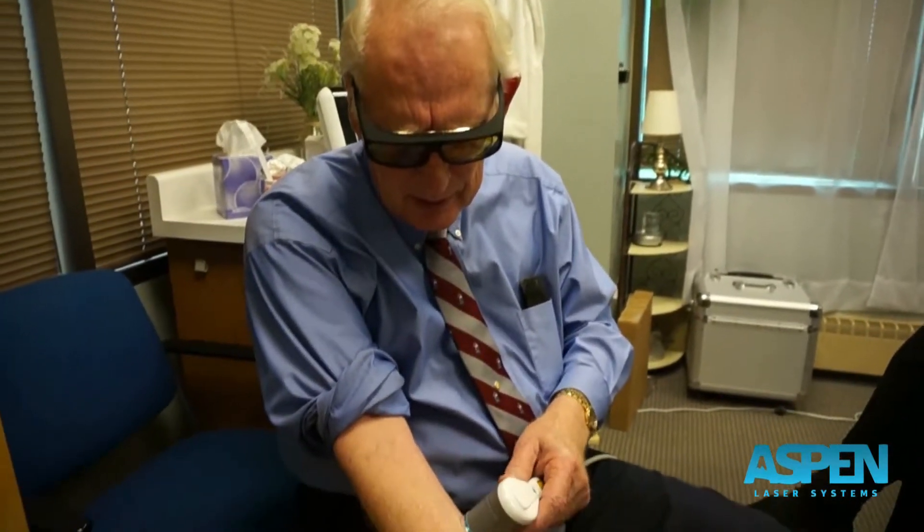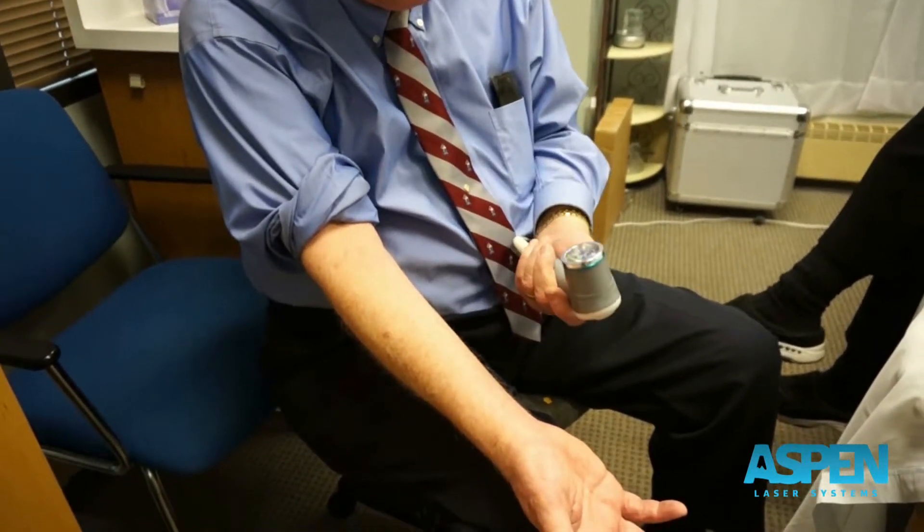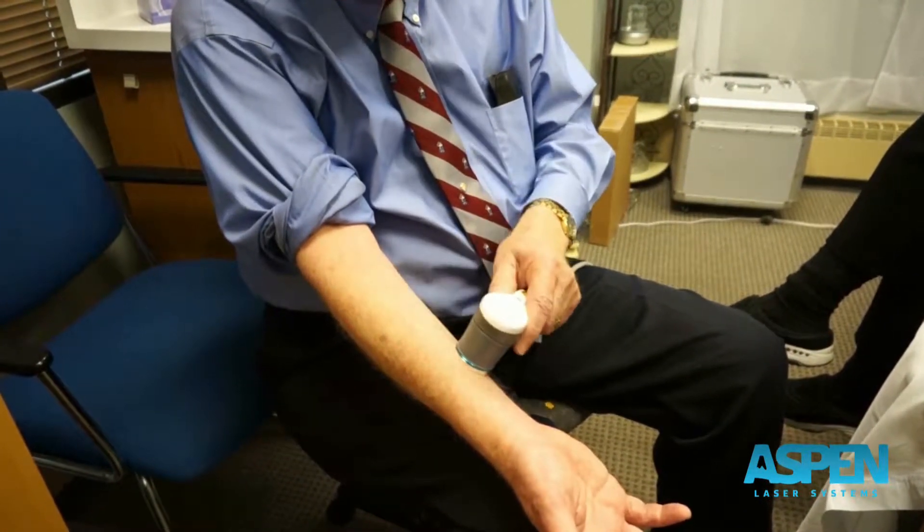A couple of things I want to talk about laser right off the bat. One of the things I like to do is keep the head of the laser — in this case the grill or the glass — as close to the skin as I can.